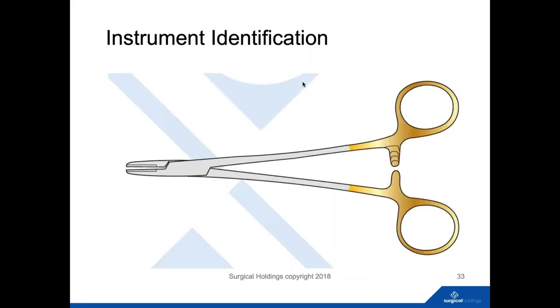Yeah, Dan, one thing I always try to share with everybody is to remind them how important it is to inspect the needle drivers. These needle holders, needle drivers are often one of the last instruments used in the surgery, and often are not clean. So they come down coated with bioburden, which can become a biofilm. But because of the different metals in the tip where the jaws are, having stainless steel, and then the tungsten carbide, and then the solder, which holds the tungsten carbide piece onto the needle driver, it's very susceptible to corrosion because of those three different metals reacting with one another as well.